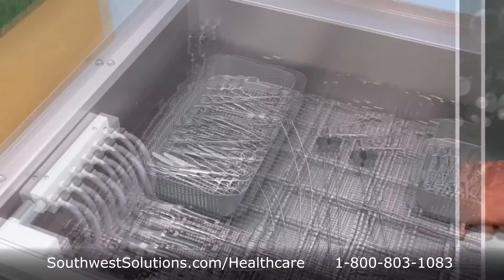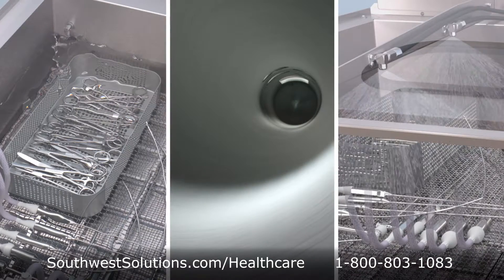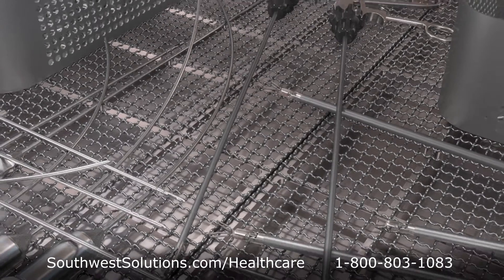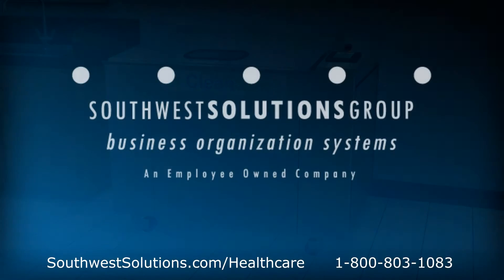After 32 minutes of these combined processes, the wash cycle is complete and the cleanliness of the instrument has surpassed AAMI standards. For more information on cannulated instrument automatic multiprocess washers, call us at 1-800-803-1083 or visit southwestsolutions.com/healthcare.